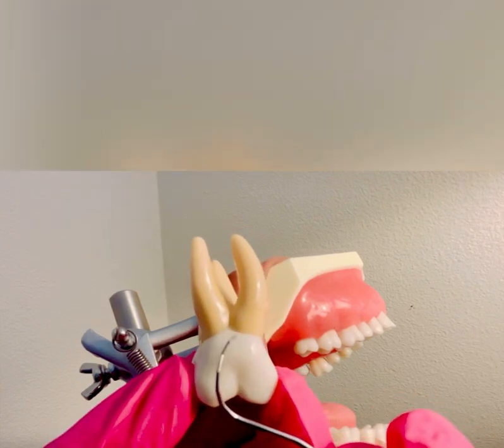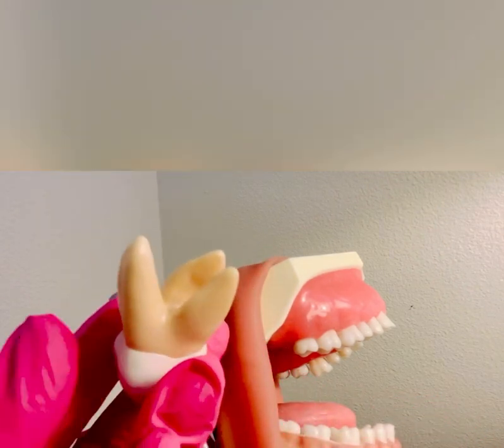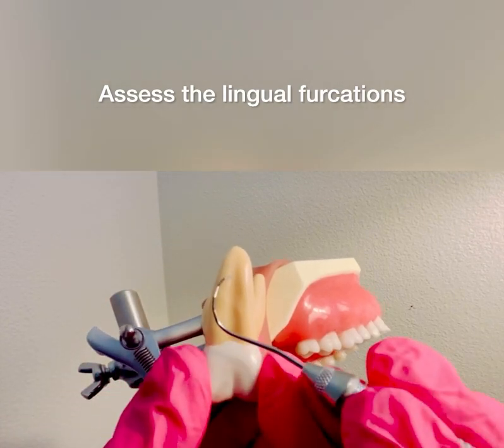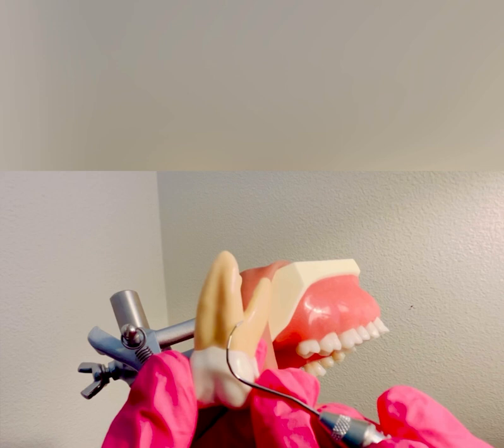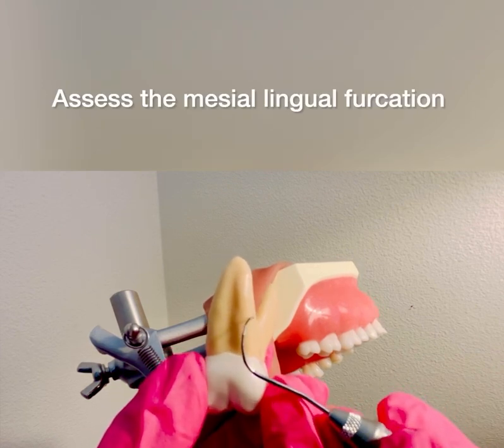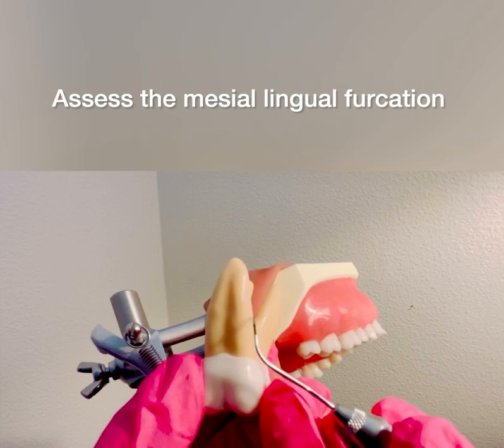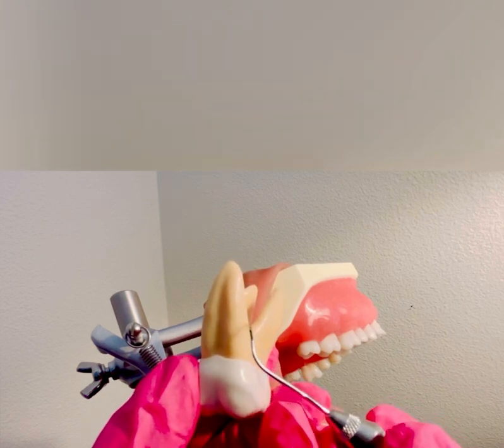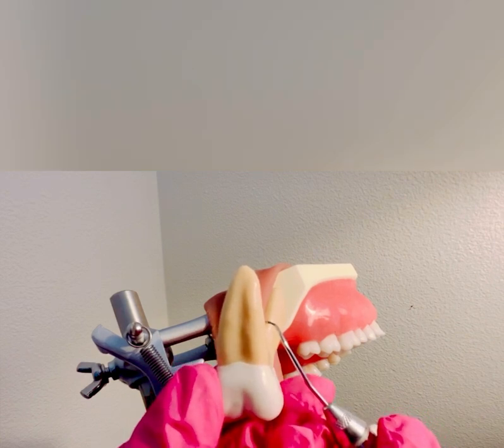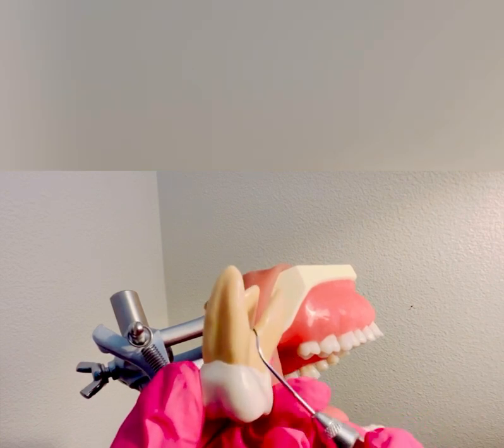That's how you assess the buccal side. Assessing the lingual furcation involvement, you do have this palatal root, so you would start right around that mesial line angle. Again, I use a light sweeping motion, and once I feel that furcation — if there is a furcation — I will roll right into that mesial surface.